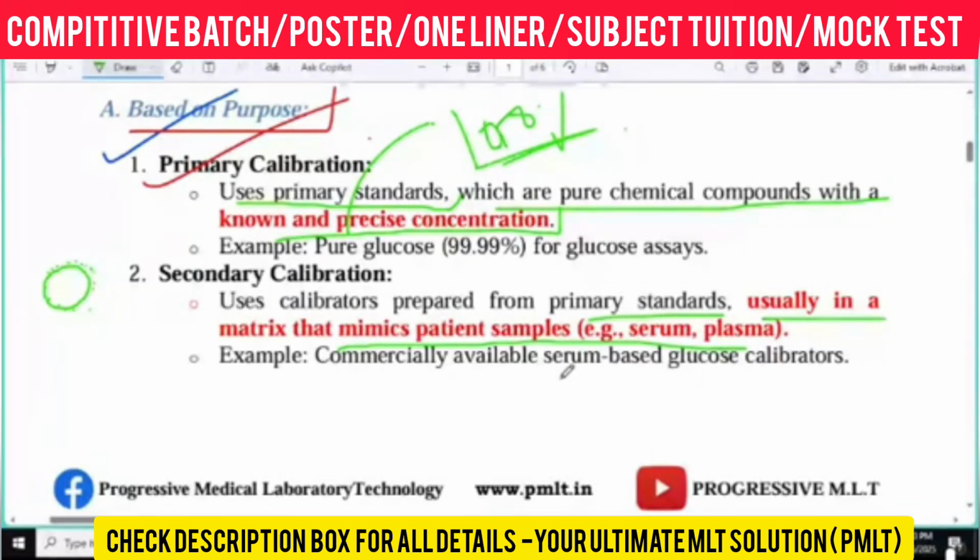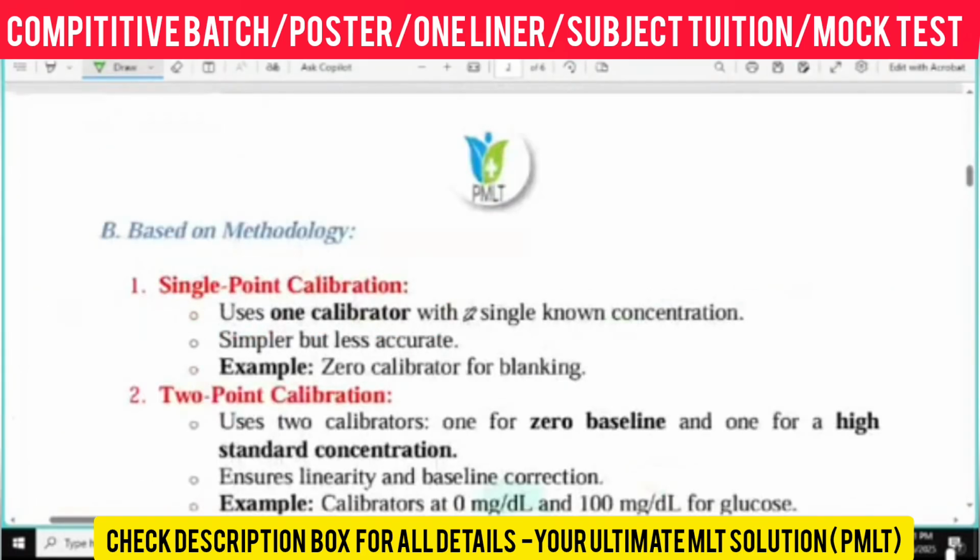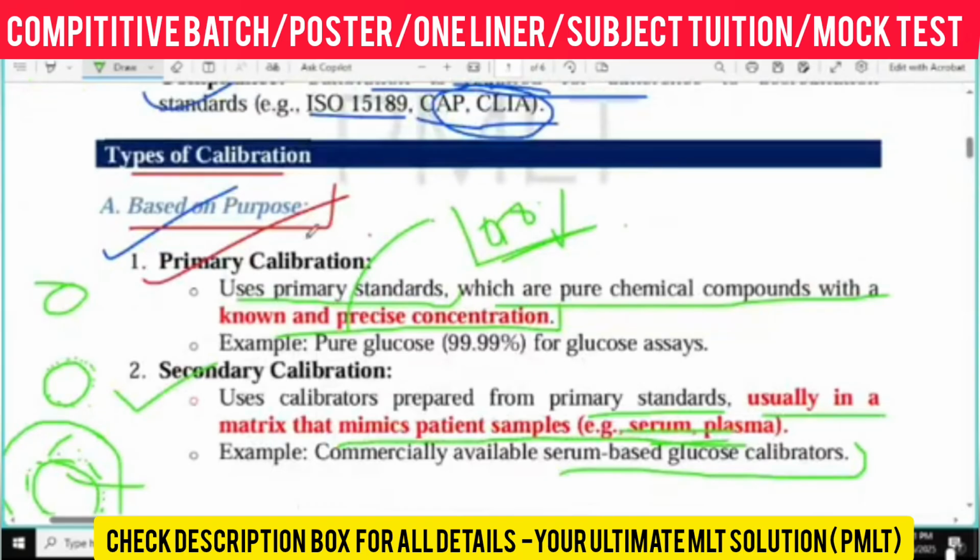See here, a serum-based glucose calibrator, so there should be a glucose standard and the serum of some patient present. That is the secondary calibration, because you are teaching the instrument that it's a serum, it's a reagent of glucose, it's the standard of glucose. You can purchase it commercially. Primary calibration does not require any serum or plasma in its surroundings, but secondary calibration requires these things. Okay, clear? Based on the purpose, that is primary and secondary.